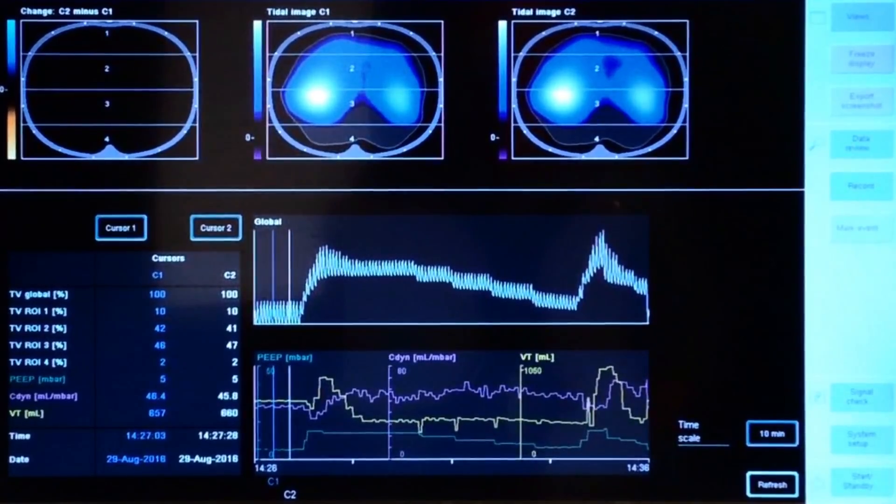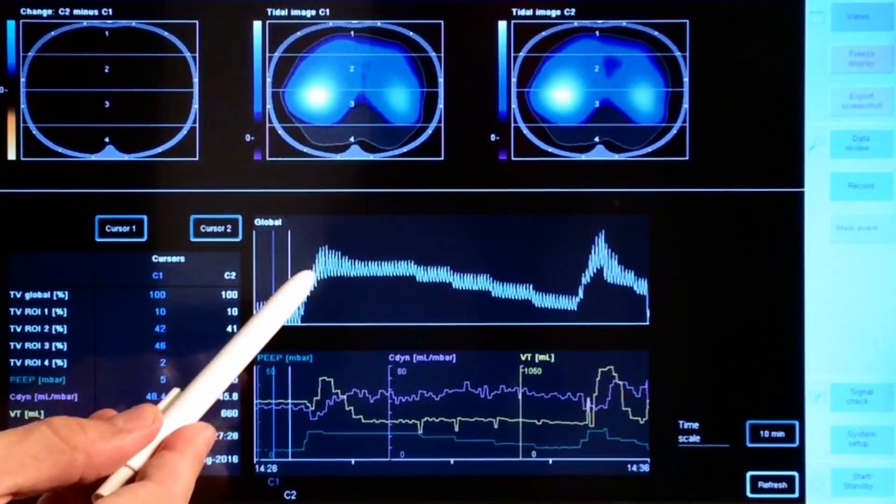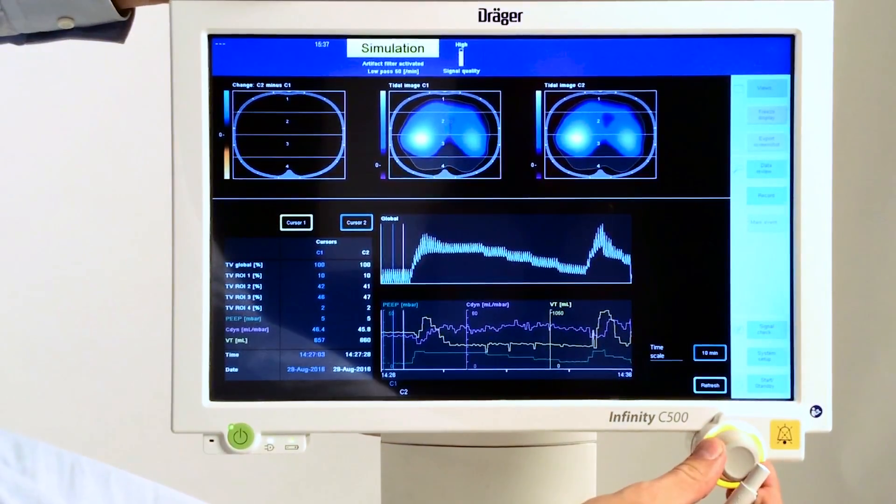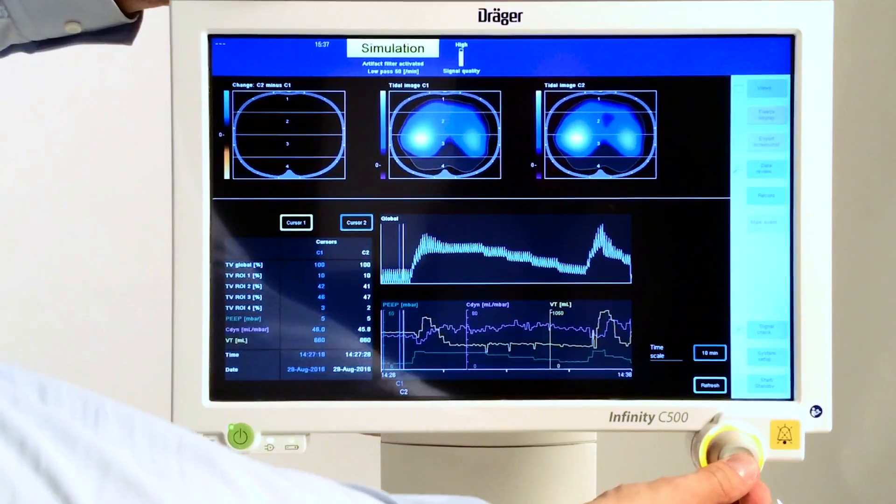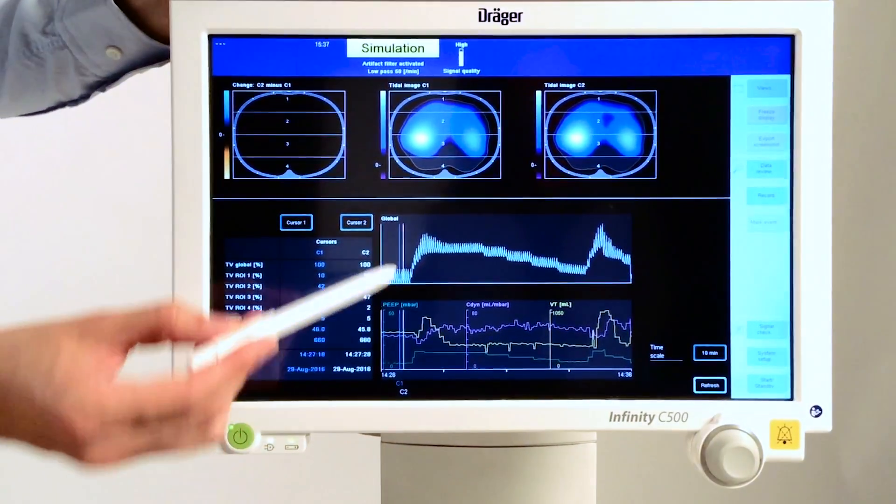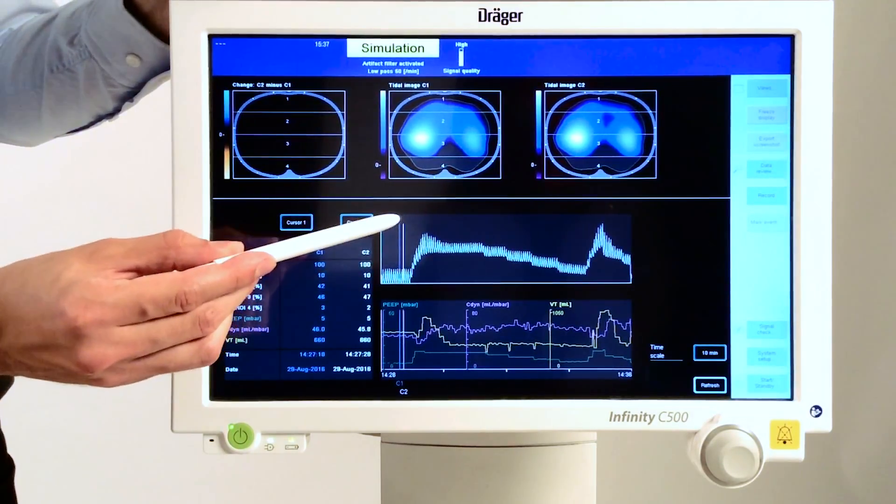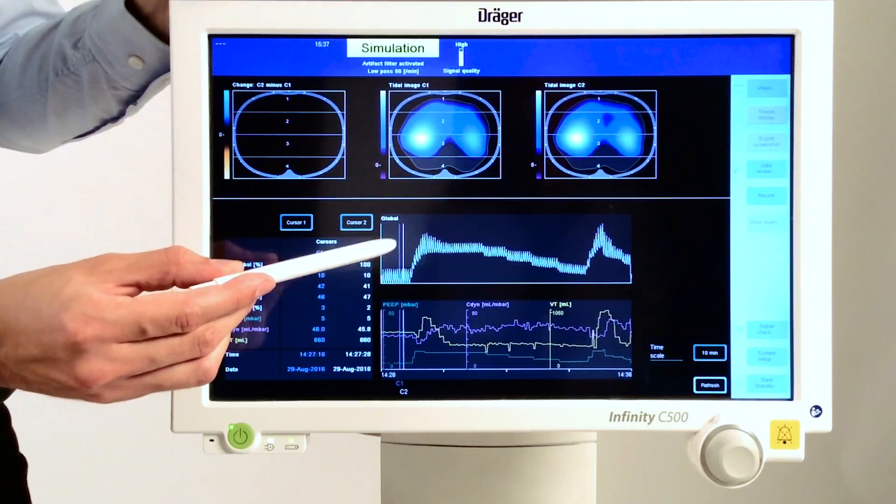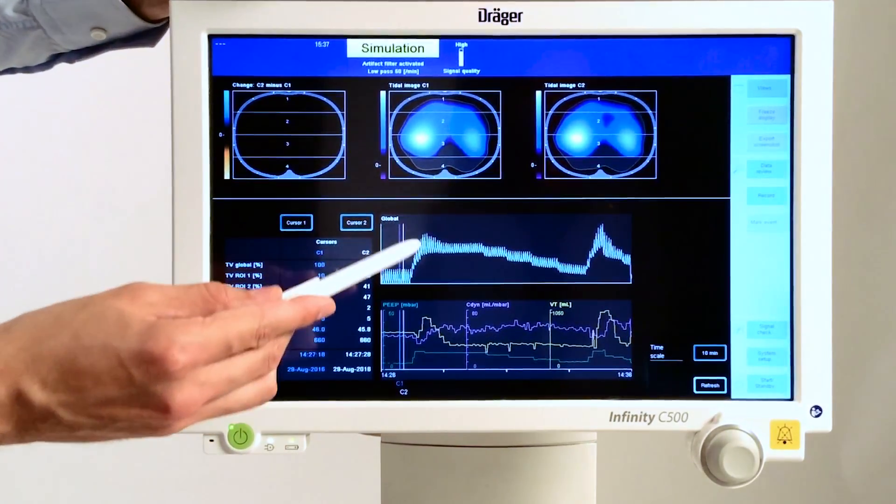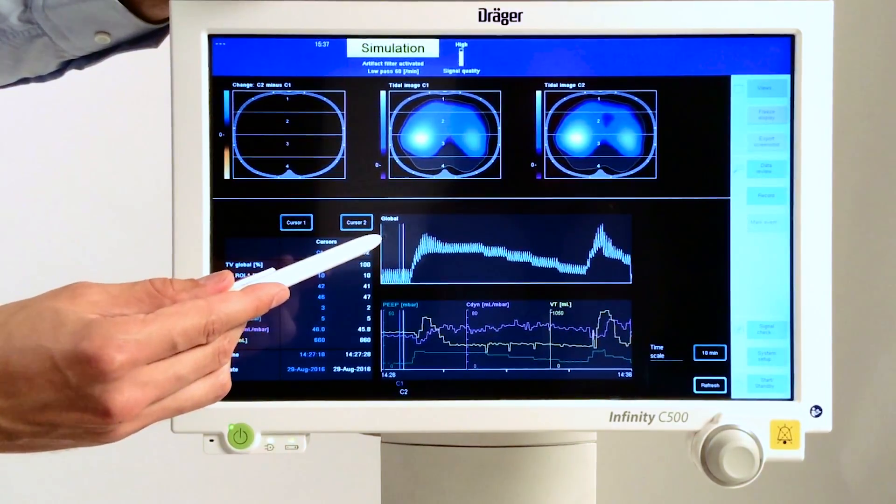First, we set a reference point before the recruitment maneuver, ideally two or three breaths before the beginning. We can also see an amplitude increase in our global impedance curve. This is caused by an increase in delta P, which led to higher tidal volumes during the recruitment maneuver.